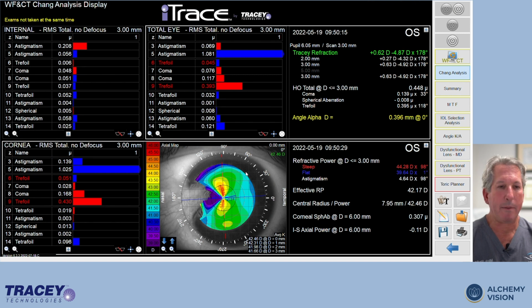So here's a patient that came to us for cataract surgery. And sometimes our patients are coming directly for a pre-op visit being sent in by an optometrist. And so the first time we're seeing them is actually at their pre-op visit. And unfortunately, optometrists or other eye care providers don't necessarily tell us the full history of the patient.